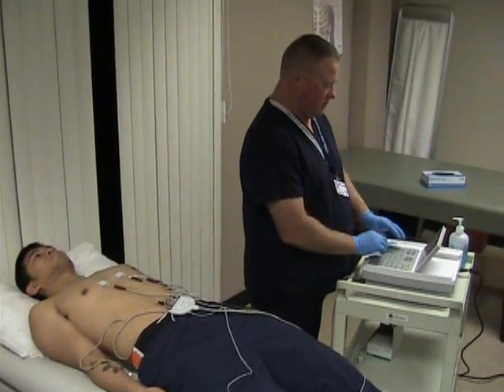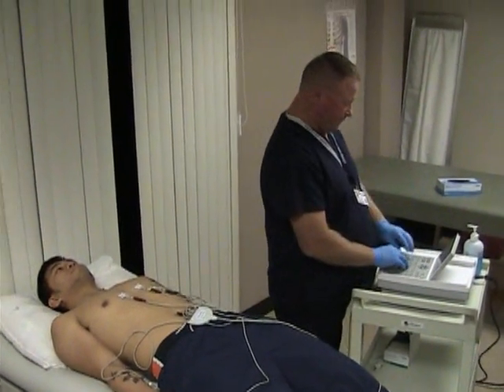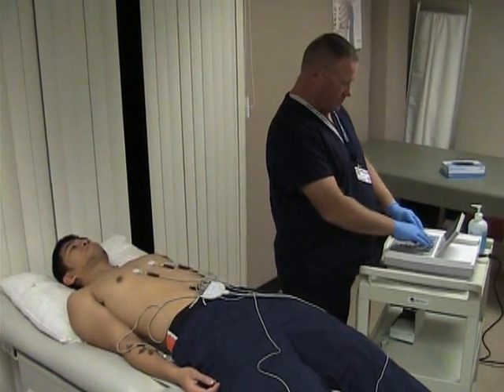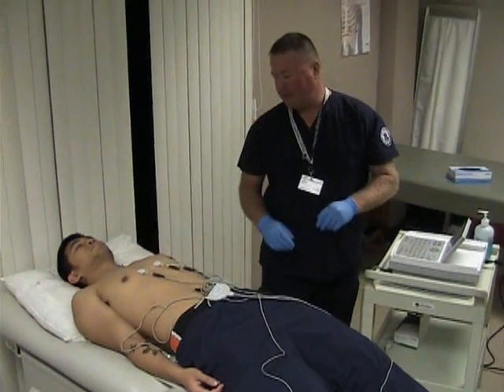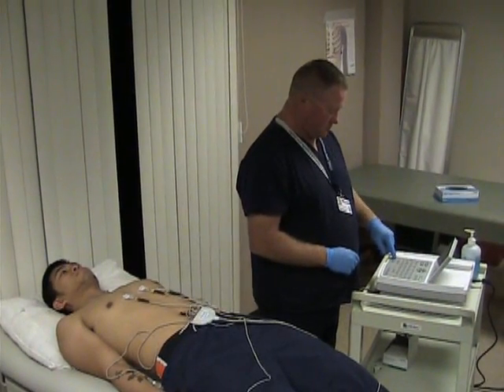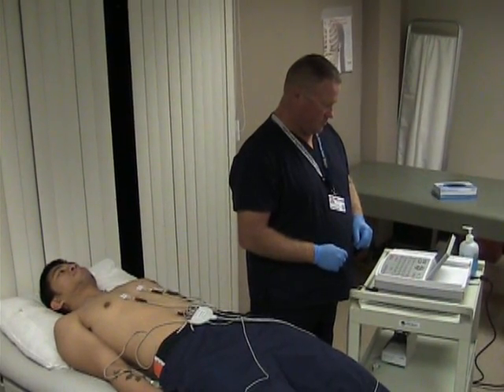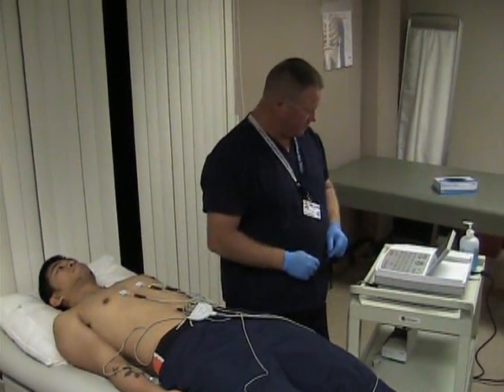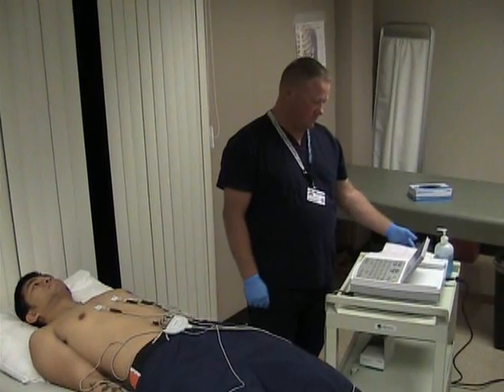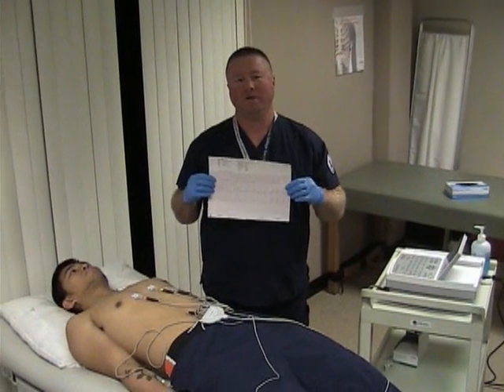And your gender is male. Any medications today? No. Please lay still while we take this EKG. And that's how you perform an EKG.